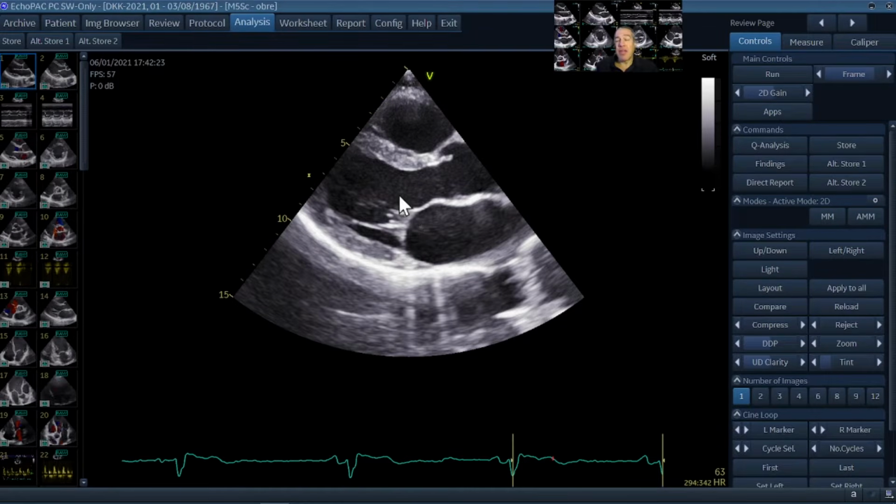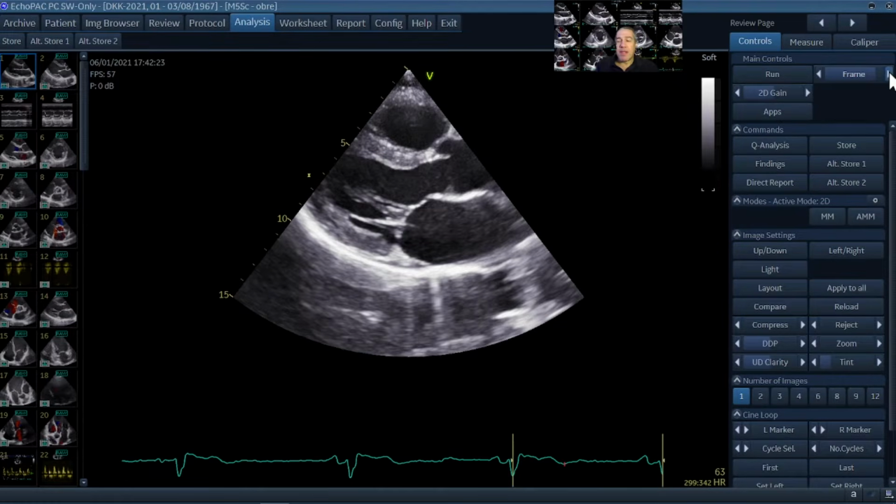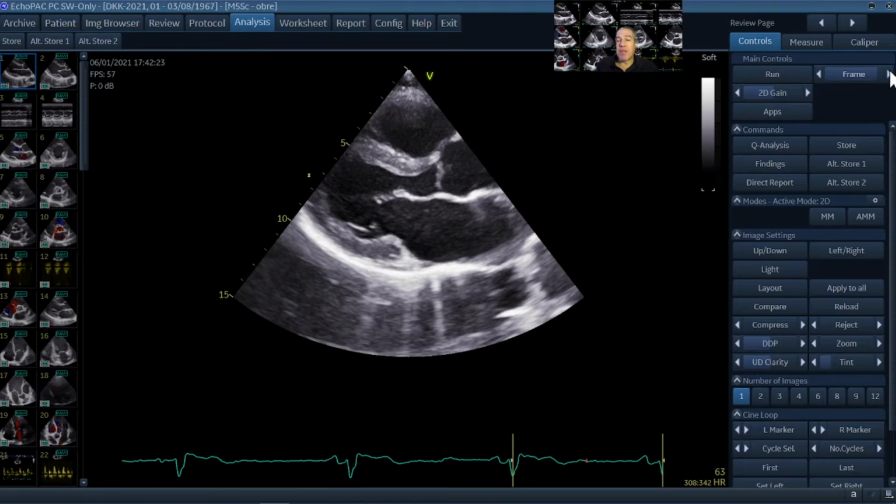And now here during left ventricular contraction, obviously the mitral valve is closed and the left ventricle is ejecting blood into the aorta. If you go on frame by frame, you will notice that at some time here now the aortic valve, I go back, is open and it's closing, and now the mitral valve starts to open.